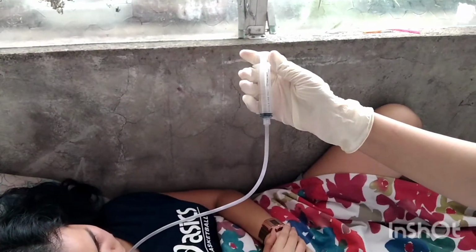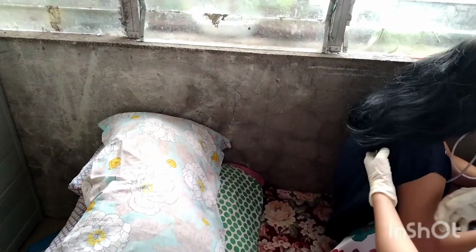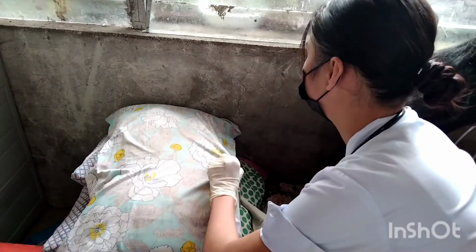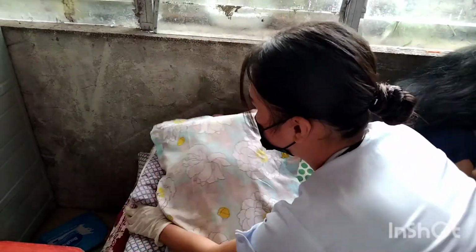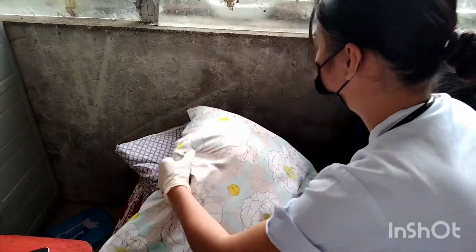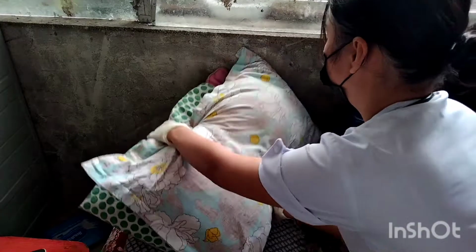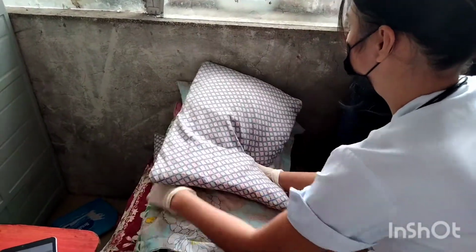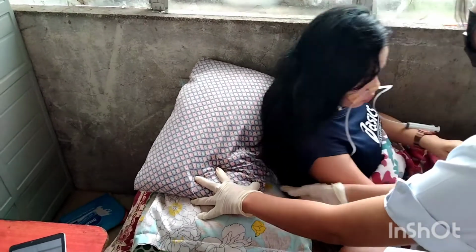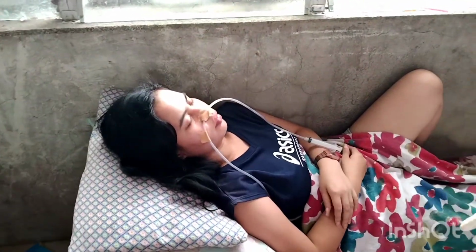Step number 4 is to place client in high Fowler's position or elevate head of bed 30 degrees. If a sitting position is contraindicated, a slightly elevated right side lying position is acceptable. Elevated head helps prevent aspiration. These positions enhance the gravitational flow of the solution and help prevent aspiration of fluid into the lungs.